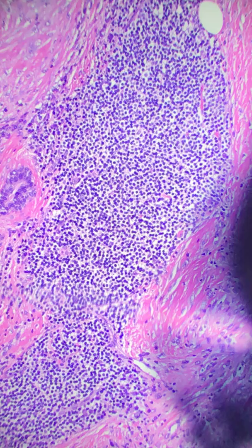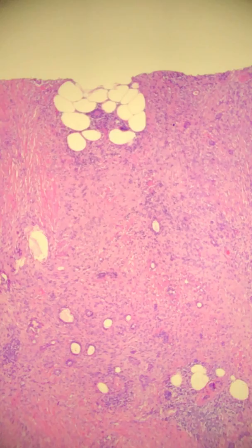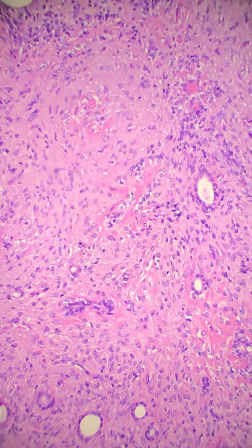And at this point you might be thinking, okay, well, can I see other things? Like, what about the other metaplastic lesions? We can have squamous cell carcinomas that have spindle cell change if they're more poorly differentiated. And when do we consider things like malignant myoepithelioma? Pretty much what you're looking at with these is, one, if the lesion itself looks epithelial, or your immunohistochemistry is leading towards epithelial differentiation, so that would be like your keratins, which we'll get into how those look, and I have some IHC to show you today.